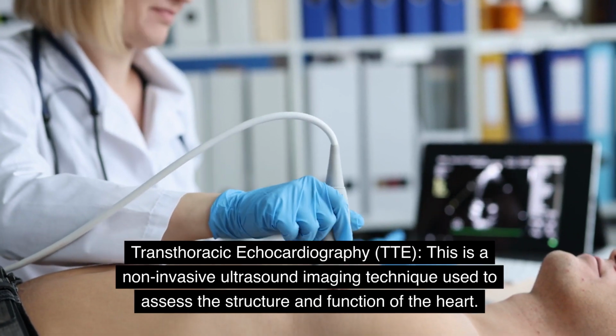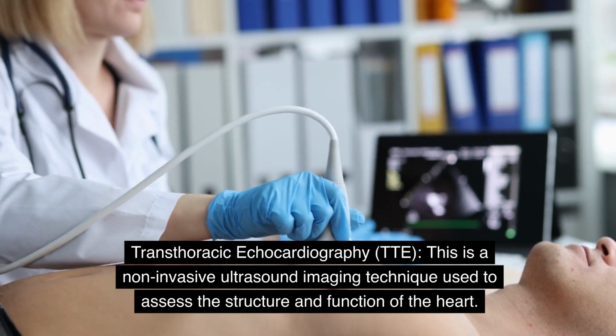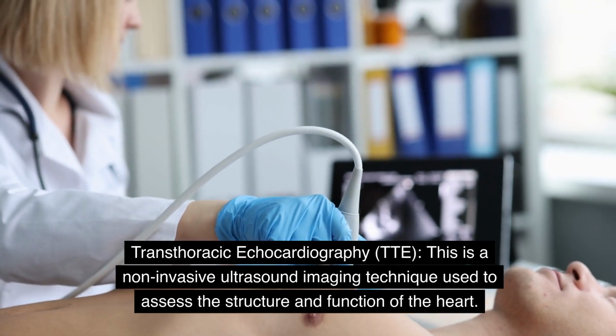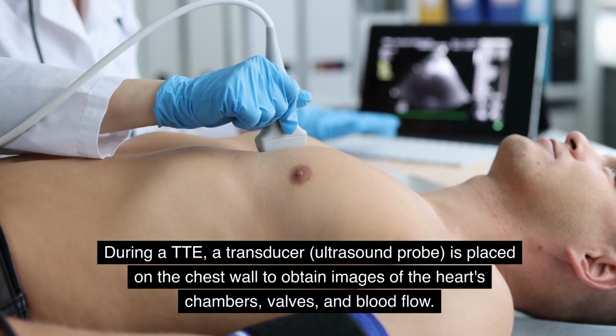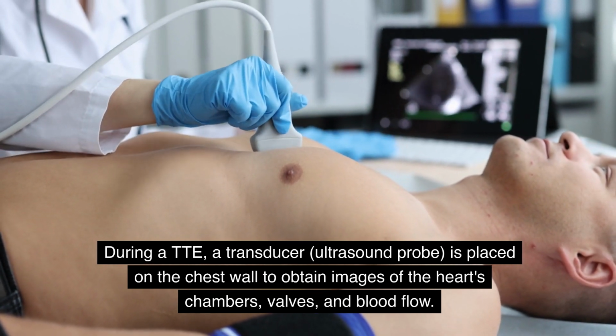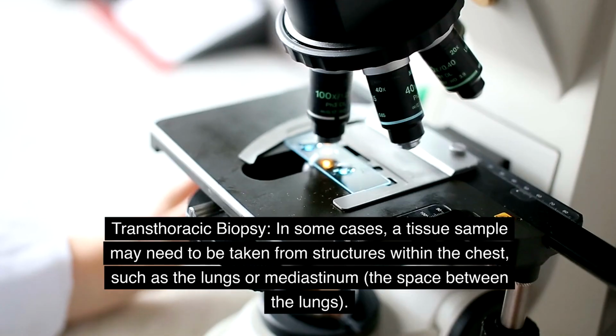Transthoracic echocardiography, TTE. This is a non-invasive ultrasound imaging technique used to assess the structure and function of the heart. During a TTE, a transducer, ultrasound probe, is placed on the chest wall to obtain images of the heart's chambers, valves, and blood flow.